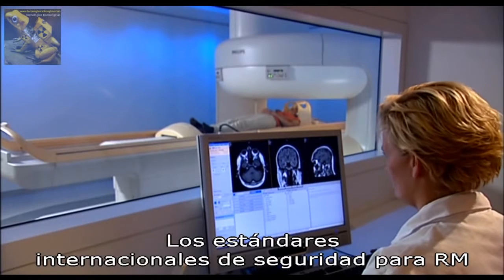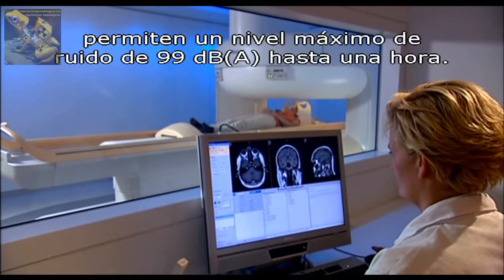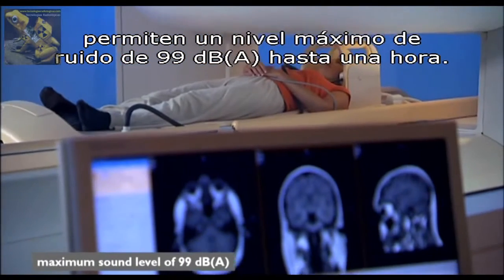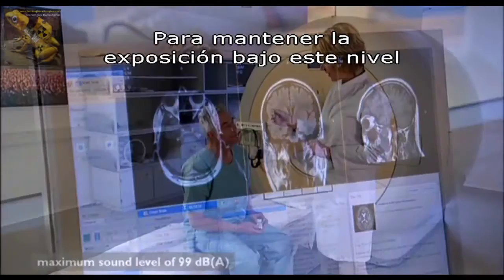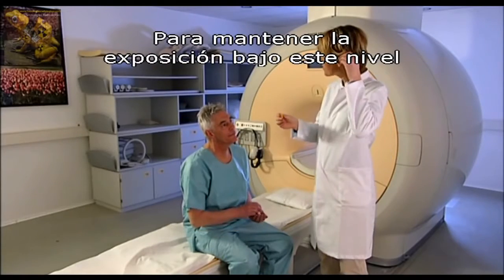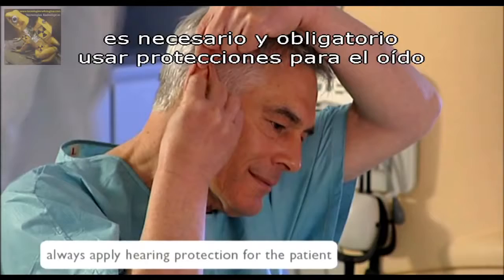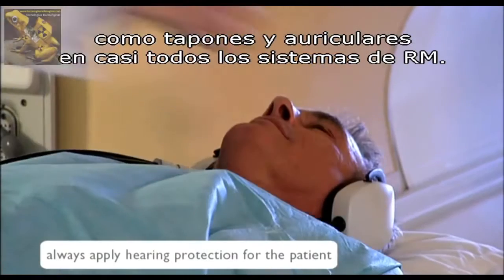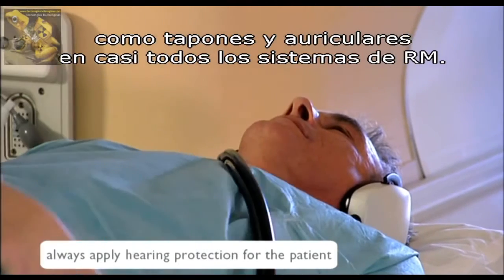International MR safety standards for patients allow a maximum sound level of 99 dB(A) for up to one hour. To keep the exposure below this level, some hearing protection in the form of earplugs or a headset is necessary and obligatory for almost all MR systems.